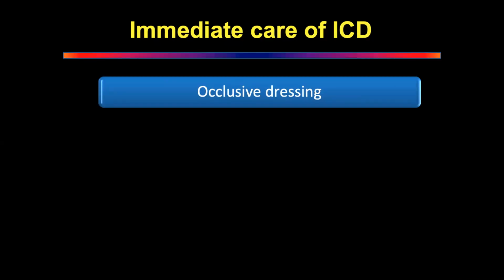It's okay. So what do you put in? You put in an occlusive dressing. Okay, next. Once you've tied it, you have to put in an occlusive dressing. Yes. Covered dressing or transparent dressing?